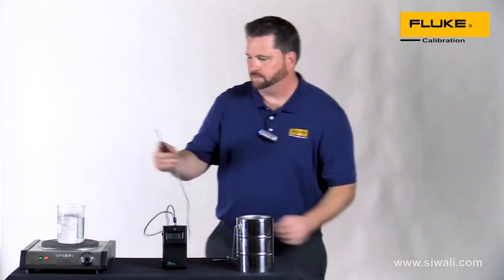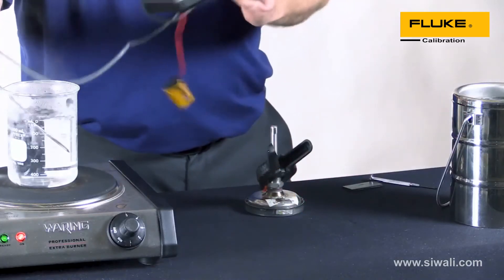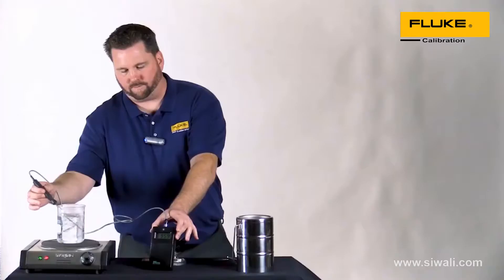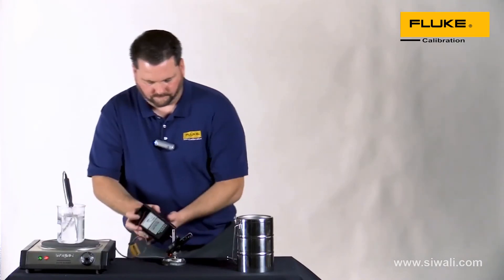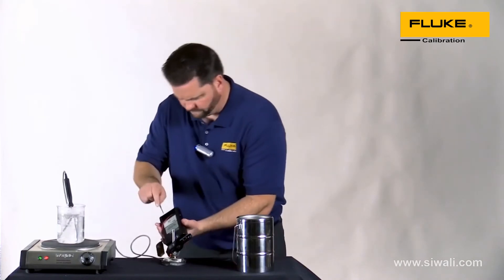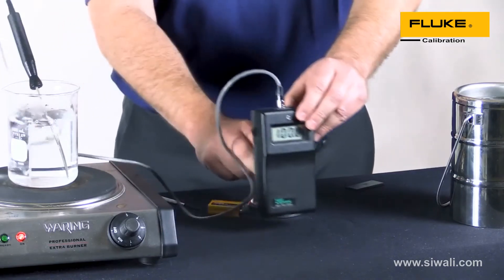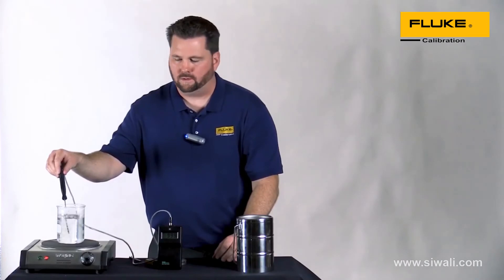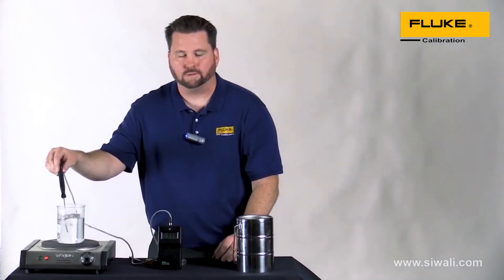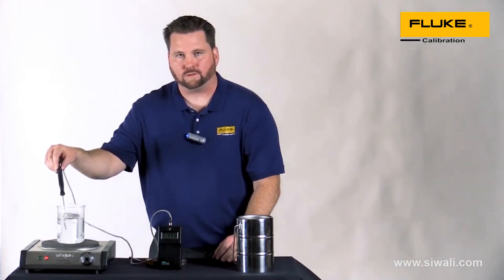It looks like we're bobbling around about 95 and some change, so let's make a quick adjustment on the top end. I've made the adjustment and now we've got it close to 100 degrees Celsius.